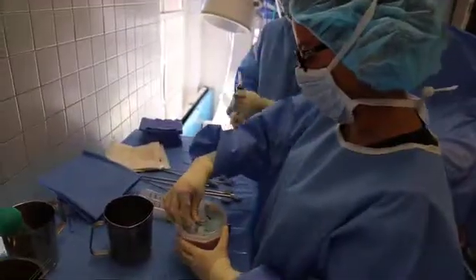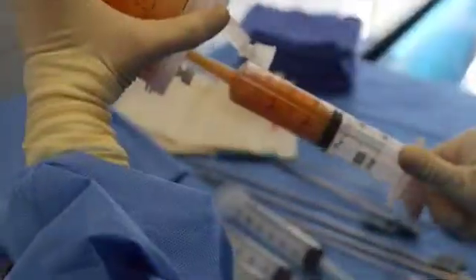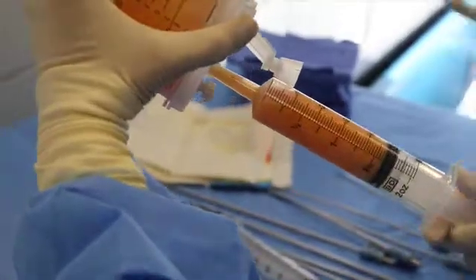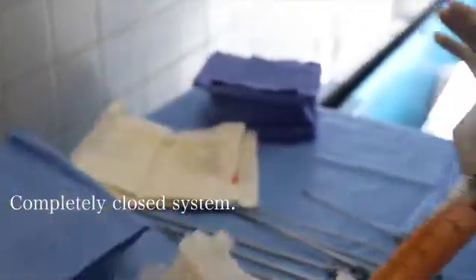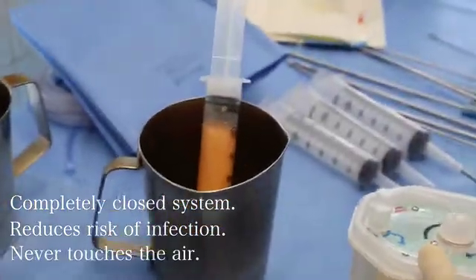These are special catheter tip syringes that fit into this thing. Now she's getting the fat out. Look how clean it is. And it's a completely closed system, so it really decreases risk of infection. It never touches the air.